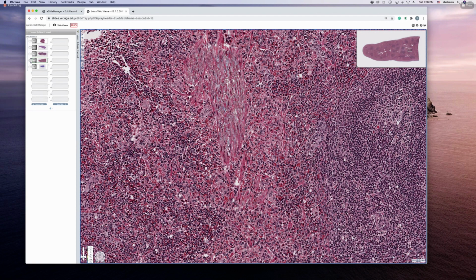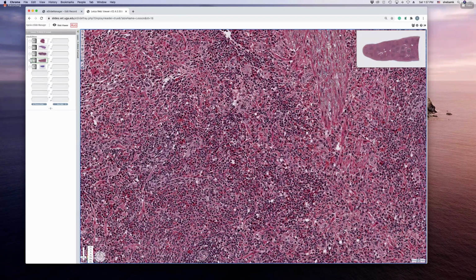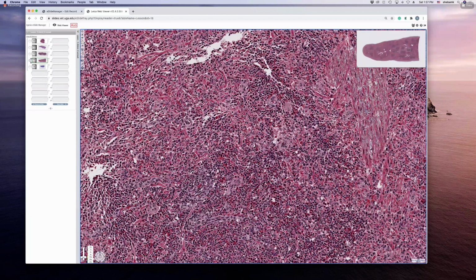There is an ellipsoid. Look at that. You just have to go around hunting for them. Once you become good at identifying them, those are the sites where macrophages are sitting, ready to engulf the dying red blood cells. Ellipsoids you'll be able to see only in the bovine spleen. You won't see them very nicely in the other spleen. So that is it.